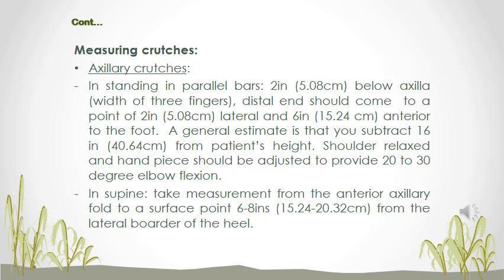Then you position the arm piece under the axilla, and there should still be 3 fingers of space between the axilla, the armpit, and the rubber part.